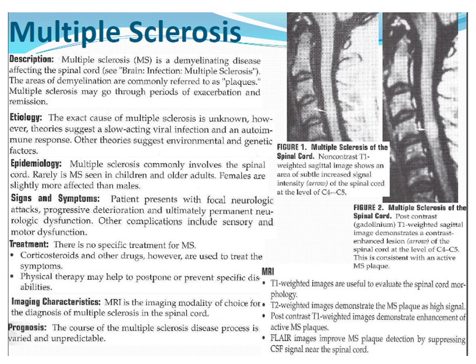In the brain, you'll also be doing diffusion-weighted imaging for this. I think occasionally some people may do diffusion in the spine, but it's not super common. These patients will usually come in with the known diagnosis of multiple sclerosis in the brain. Then they'll order a cervical spine and a thoracic spine to see if there's any disease there. And these ones will always be with contrast administration. If you ever see one ordered without contrast and the indication is multiple sclerosis, you'll probably be checking with the radiologist or the ordering doc to make sure that they don't want to add contrast to that.